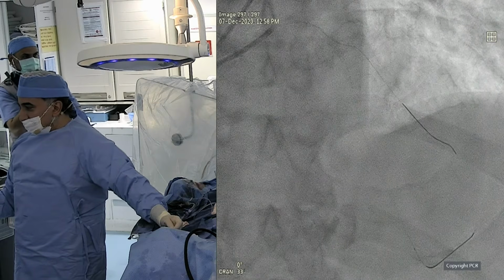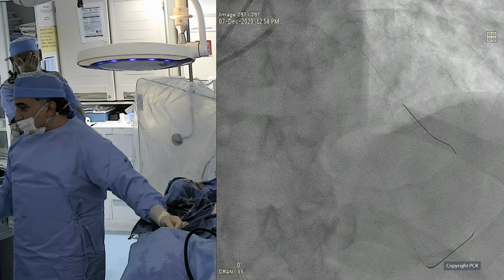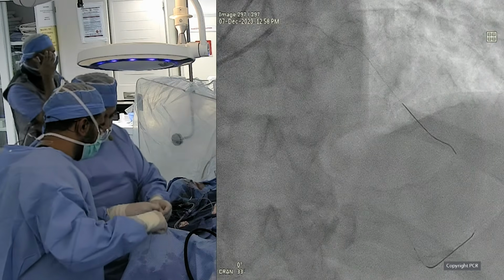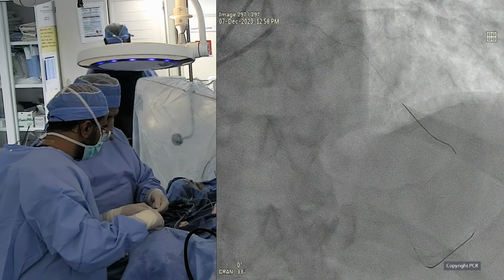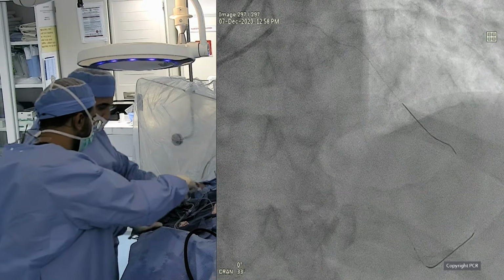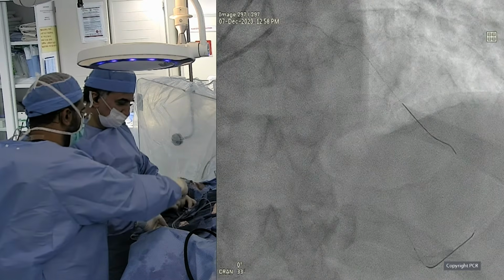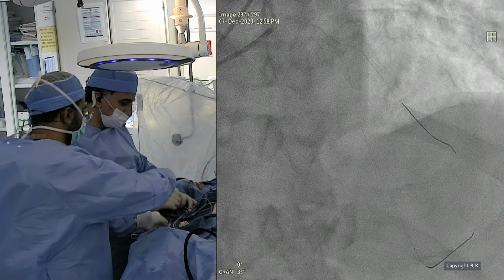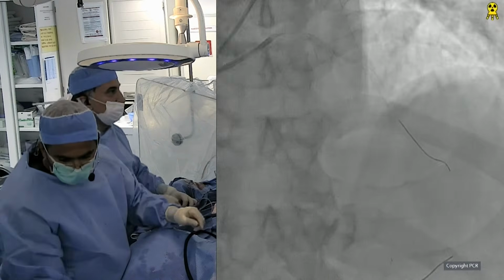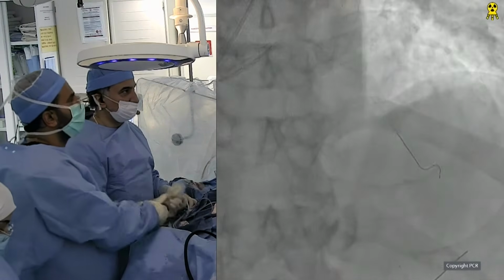Yeah, I agree with Giulio completely that the decision regarding possible upsizing of the burr size can be based on the imaging at this point. And regarding the diagonal, I agree with the team that we should focus first on the LAD and then just leave the wire in the diagonal, which gives us safety accessing if necessary. But I will not open two territories before I decide the pre-dilatation strategy and stenting of the main vessel, and then focus on the diagonal. Perfect.